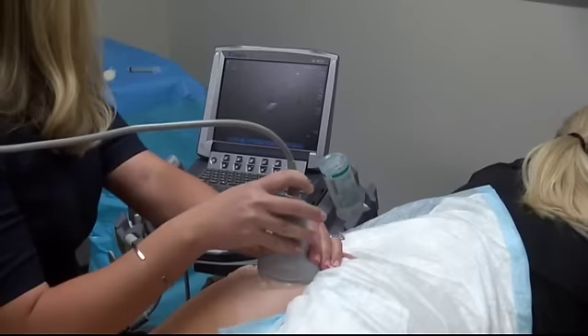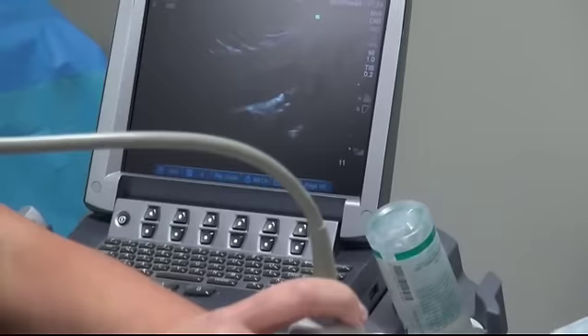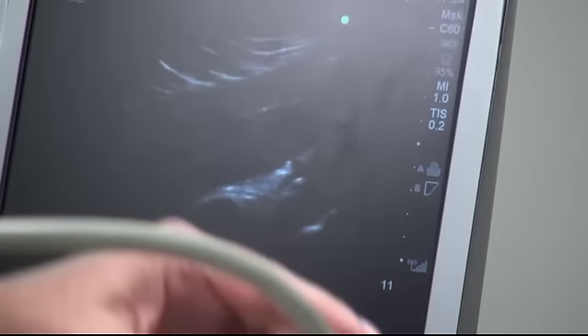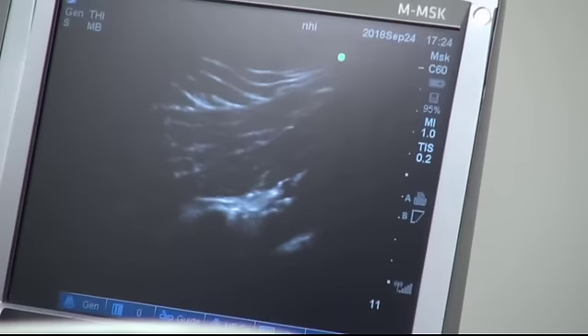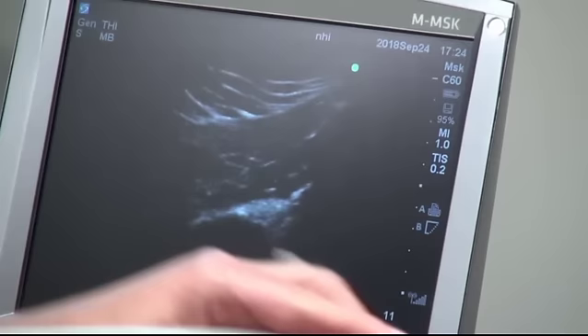The transducer is placed in long axis with the piriformis. The piriformis musculature is visualized in long axis and the sciatic nerve is the hyperechoic structure beneath the piriformis, visualized in short axis. The lower extremity is rotated allowing dynamic visualization of the muscle from the sacrum to the attachment on the greater trochanter. The trochanter may not be within view until the patient is rotated. This muscle movement also helps confirm the correct muscle is being visualized.